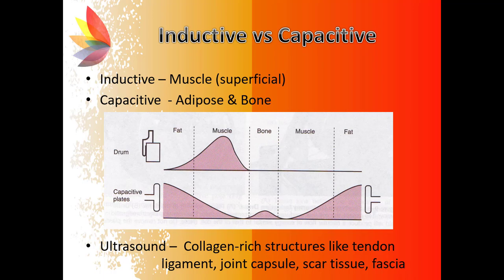Most of the heat is produced near the source of the shortwave diathermy unit and just below the adipose tissue or muscle interface. Increased adipose tissue thickness will reduce the rate and the magnitude of intramuscular heating. Capacitive is not recommended for patients who have large layers of adipose tissue.